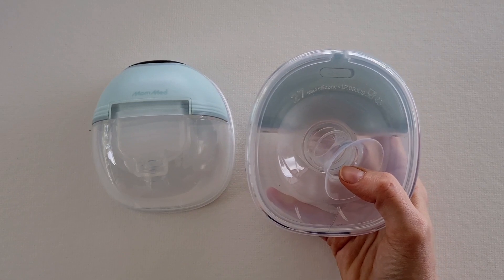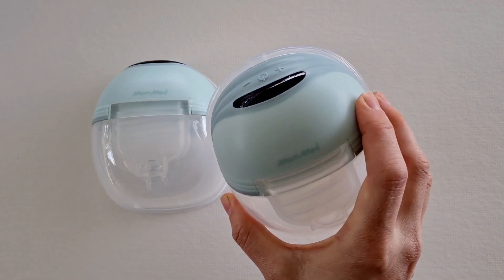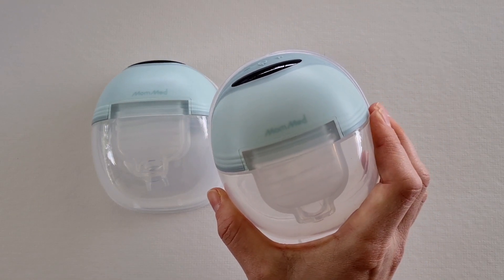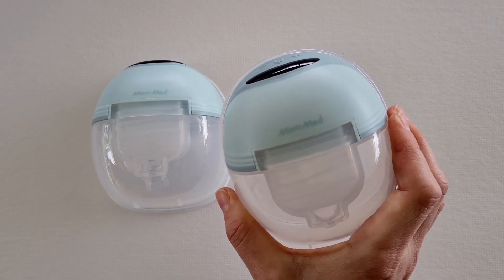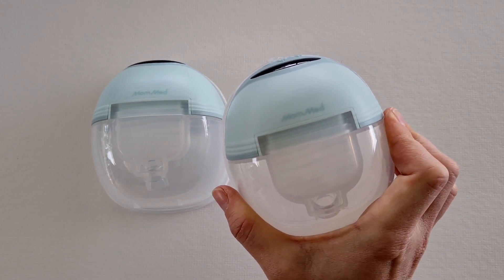If you have a larger nipple size then this might be a fantastic pump for you. Overall, I think this is a great wearable pump at a really affordable price — it's jam-packed with features that you would expect on some of the more expensive pumps.